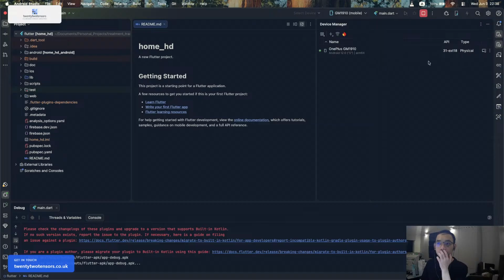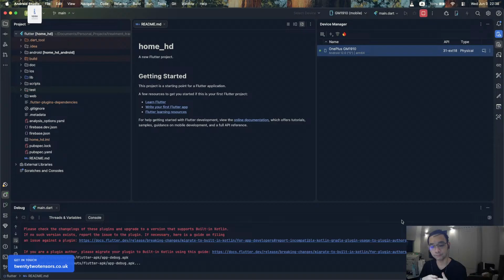when I'm done showing the app, if I get to show the app on my mobile, I will show you what it does and what it can do, and what my future direction is. So basically, it's like my app, but packaged into a portable app that everyone can use.